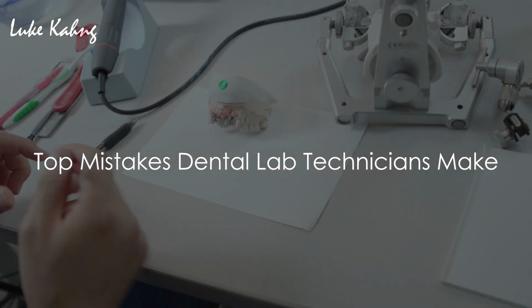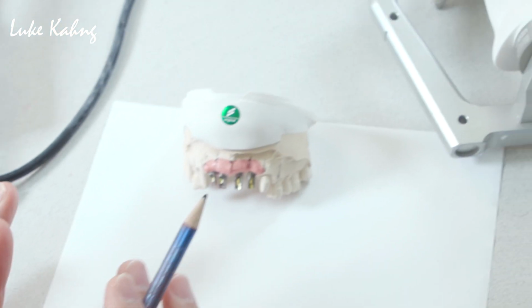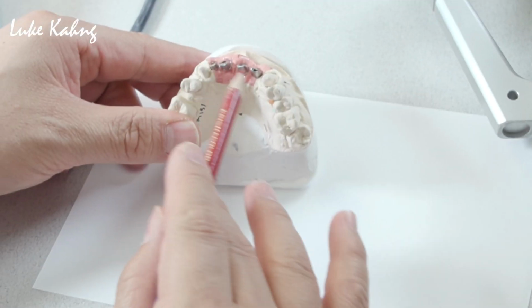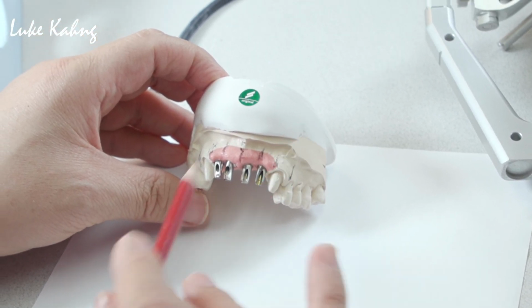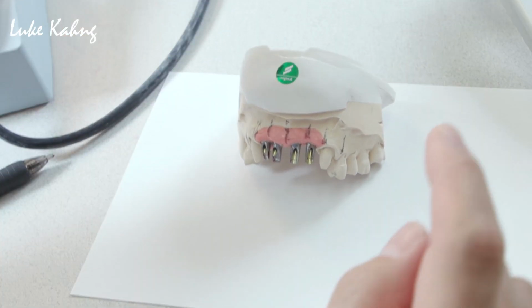This is the number one. All the time I talk to the technician not to do their own way, but follow this, okay? Meaning the implant or combo cases are very complicated cases. So the bottom looks okay, made by Straumann, whoever designed, that's good, but it was wrong. Why was it wrong? That one I would like to indicate.